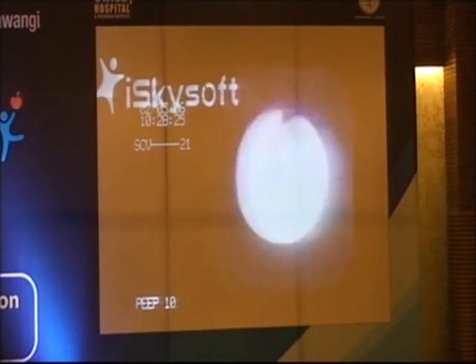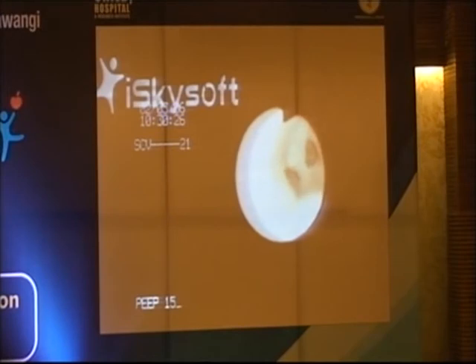Is that enough for this kid? Nope, because he's actively exhaling. The only thing that's going to overcome that sometimes is 15 of PEEP. So in these babies, this one in particular, this baby required 15 of PEEP just to keep that airway pneumatically splinted so that it wouldn't collapse every time. How many of you would feel comfortable with this PEEP level? Not many, right? Because I think for the most part, we're scared of PEEP. We're PEEPophobic.